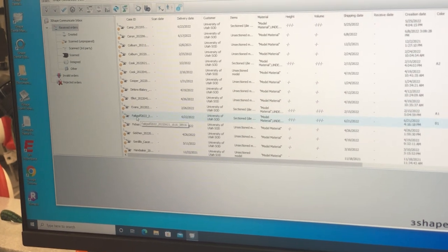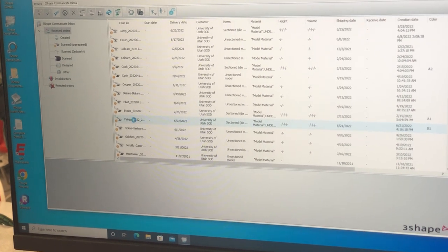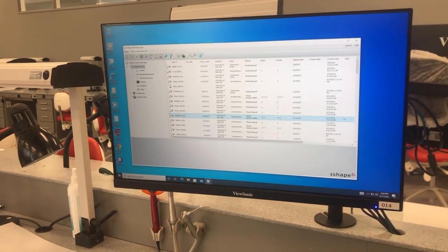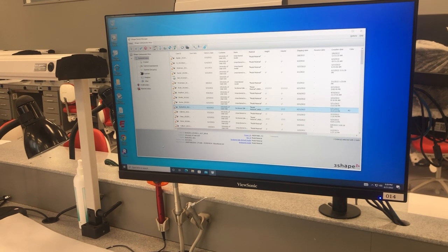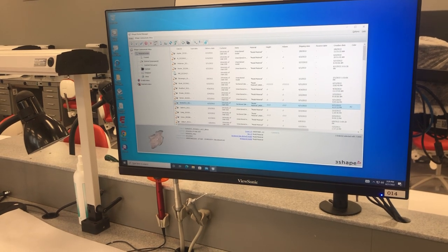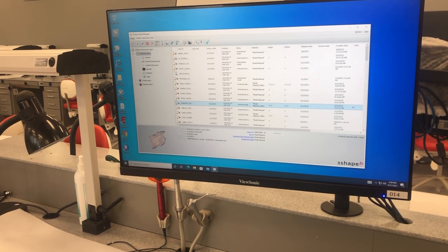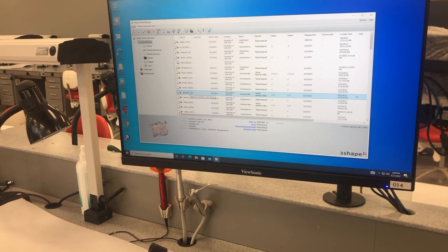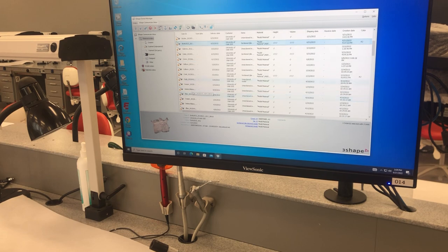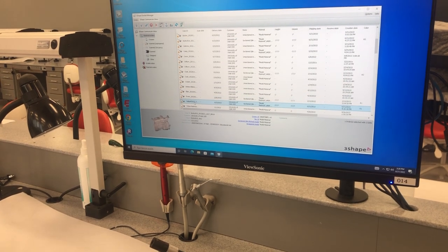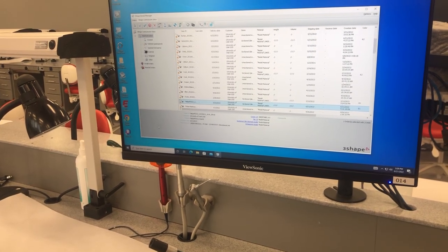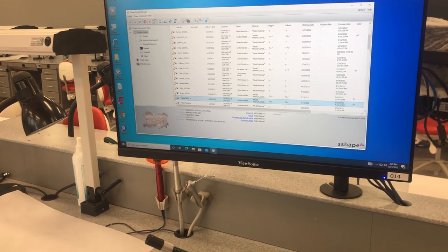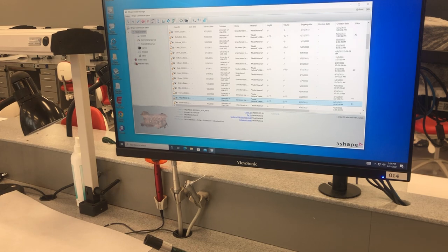This is our patient right here, so you're going to click on this. It's going to show you a little preview. There's our preview of our case.